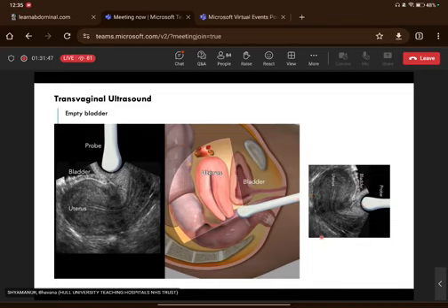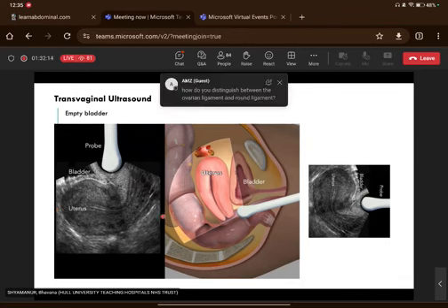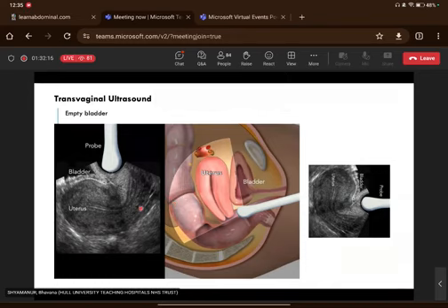So you would expect your image to look like this perhaps when you're getting a sagittal overview. But on the ultrasound screen, it is of course oriented so that your probe is at the superior aspect of the screen. So this to the right of the screen is upwards or cranially in the patient, and to the other side of the screen is caudally in the patient. So cranial and caudal, and of course this is superficial and this is deep with respect to where the probe is.